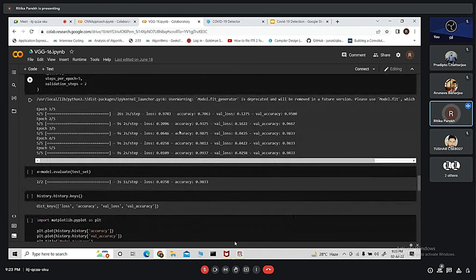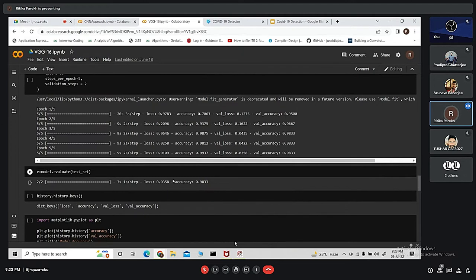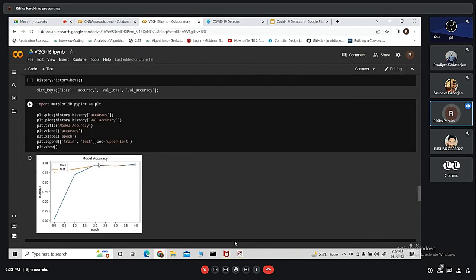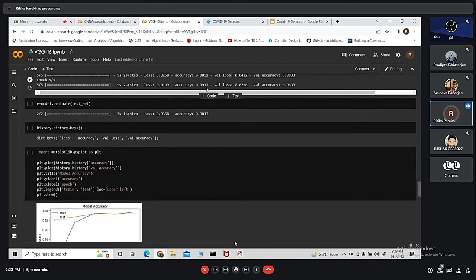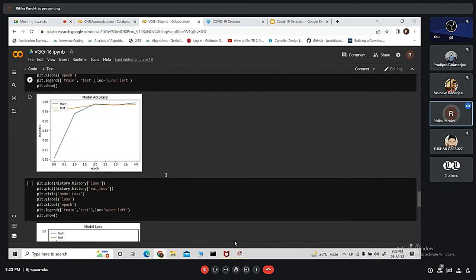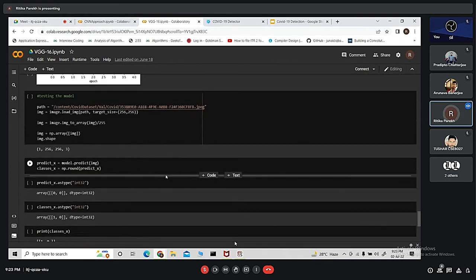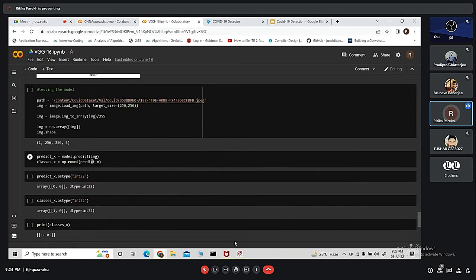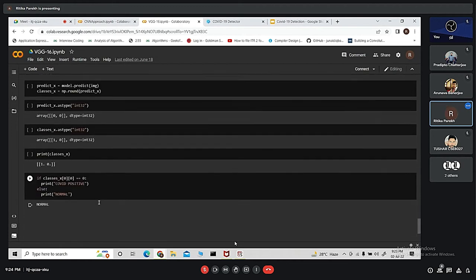Here we can see that loss is 0.9 for the first iteration, accuracy 0.7, validation loss is 0.127 and so on. Next, we are evaluating it and here we are plotting the model accuracy. Here we are plotting the model loss. These are the same values that we have received in each epoch. This is just the graphical representation. In order to test the model, we are specifying the path of any one of the image and using the model.predict function. Here we get the result. If the class is 0, then COVID positive, otherwise normal.